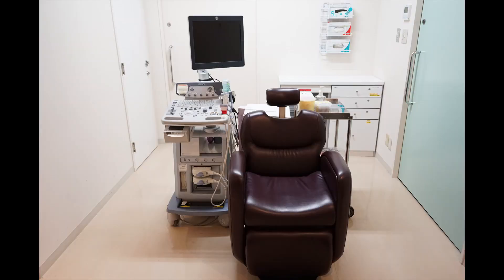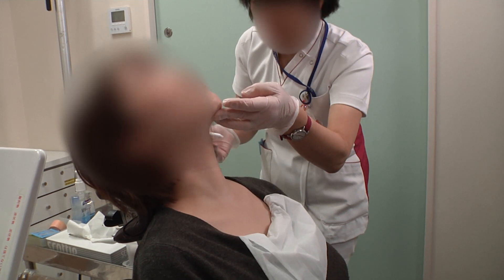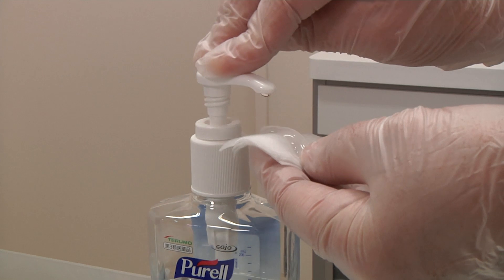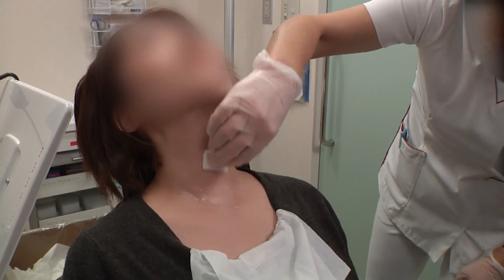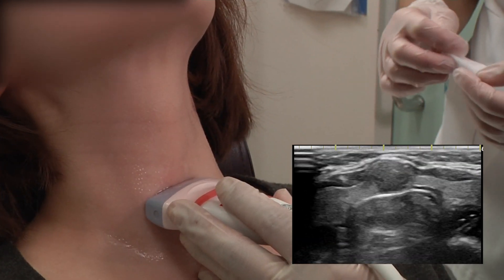This is our aspiration room, where the patients undergo aspiration cytology examinations while sitting on a barber chair. We ask the patient to look up at the ceiling. By keeping this posture, the thyroid mass is stabilized. The probe is covered with a condom, and abundant gelatinous antibacterial agent is used as ultrasound jelly. Afterwards, explore the area by moving the ultrasound probe to detect the thyroid nodule and press it using the probe.